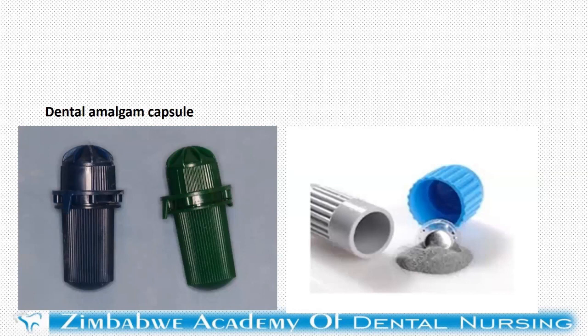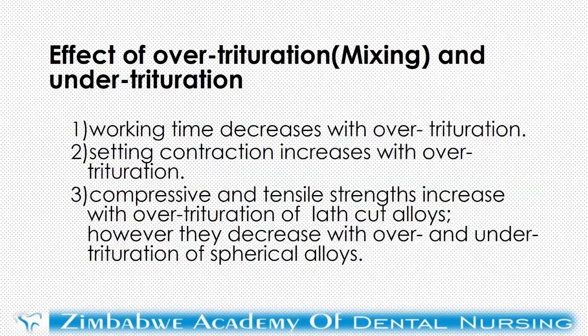open the capsule. You can see the powder there, the metal filings. You can see the shiny mercury there on top of a membrane, which was dividing the powder and the mercury on one side. That membrane is only broken once you put it in the machine to start mixing it.